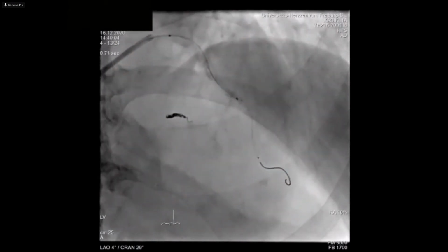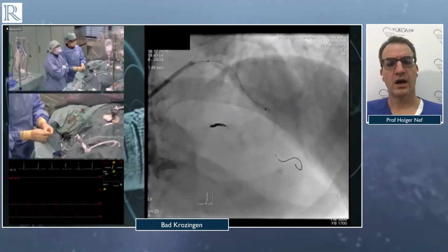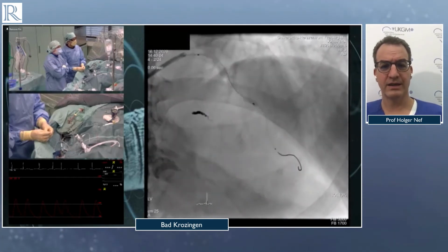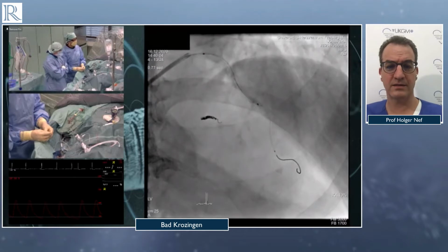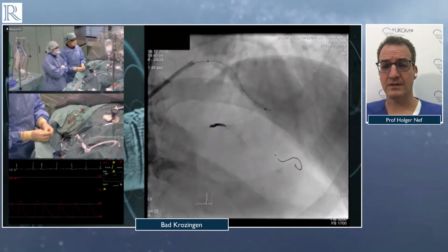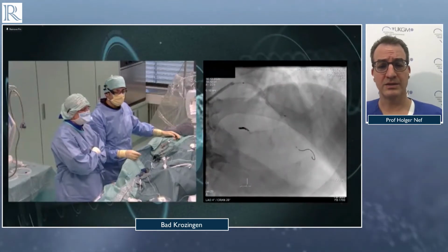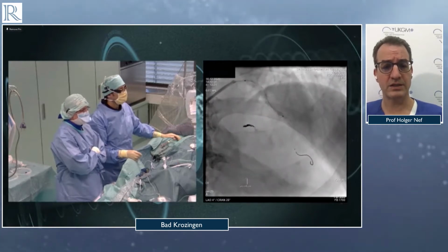You see now. Holger, is there any question from your side at the moment regarding strategy or the case? Well, thank you very much for this very exciting case, and I think we have many questions which can be addressed by this nice case, which you selected very well. First of all, just to give us a short overview about your setting, you have used now a 6 French catheter. With 7, Holger. We're with 7. 7 French. Okay, why do we choose 7 French and not 6?